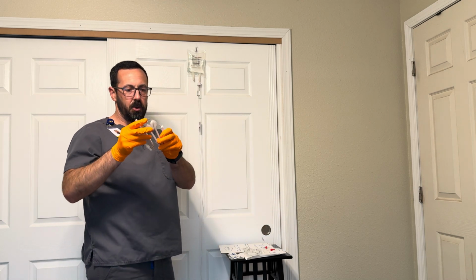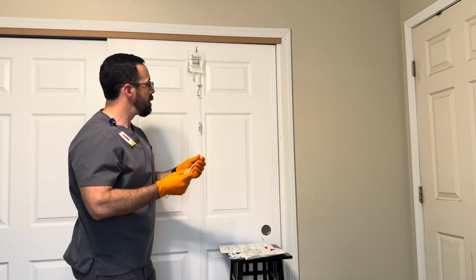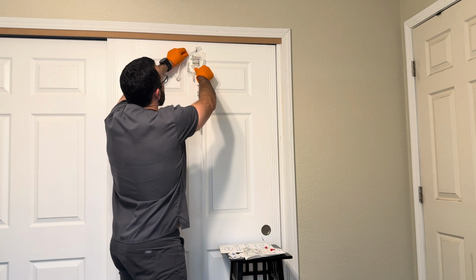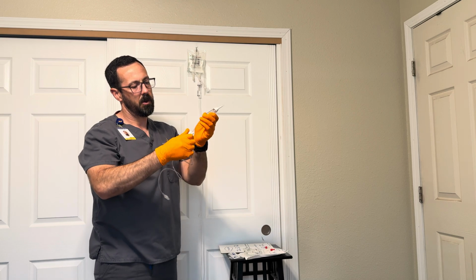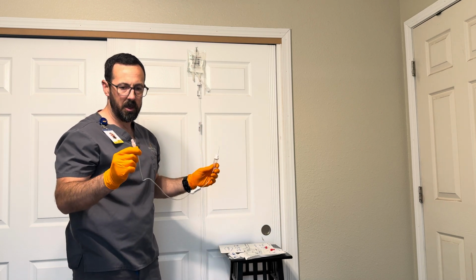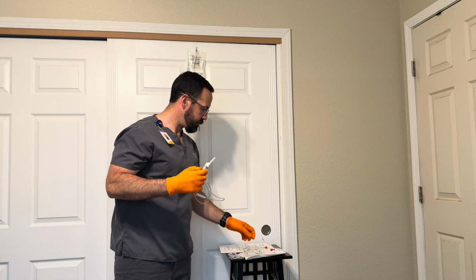I've got my secondary tubing with a hook, which we're going to use. Let's put that right there for right now. All right, so I'm going to go ahead and close my clamp. I got my connector, keeping my spike once again sterile.